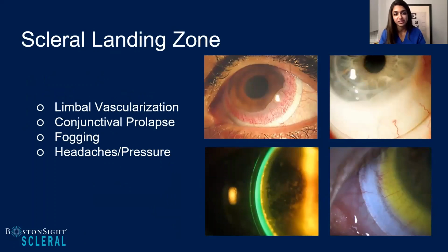Shalu, you already mentioned the limbal vascularization, prolapse, and this is again all an idea that each individual zone we're talking about is not independent of each other for the corneal health. They all work as a system together, and so one zone of the cornea might affect the limbus or vice versa. And the same thing really happens when it comes to fogging, really evaluating whether your scleral landing zone has an edge that's really causing an influx of debris.